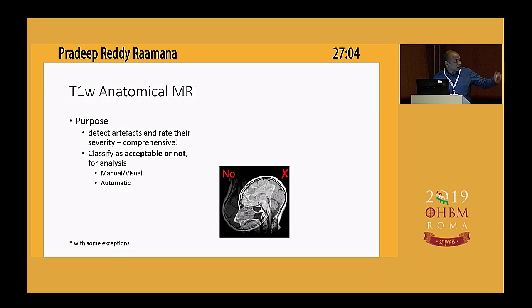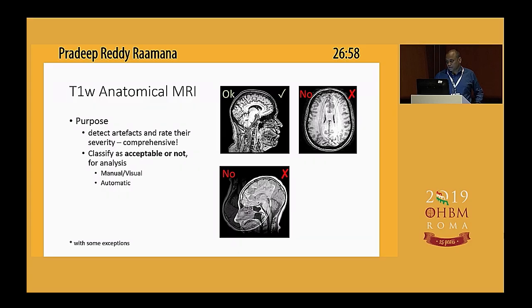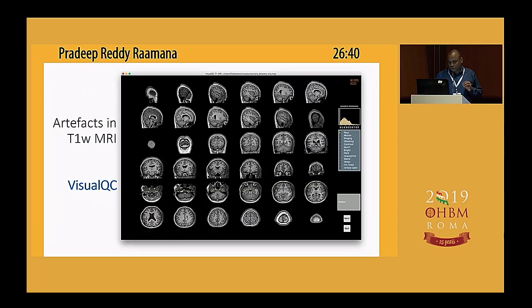For example, the ghosting artifact is very easy to detect, or the severe ringing here, but without false positives, right? So we want to be able to classify this as okay, or detect inhomogeneity really well, right? So often these tools cannot correct them, except in very basic situations.